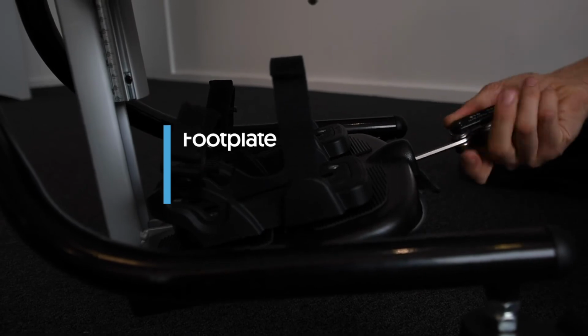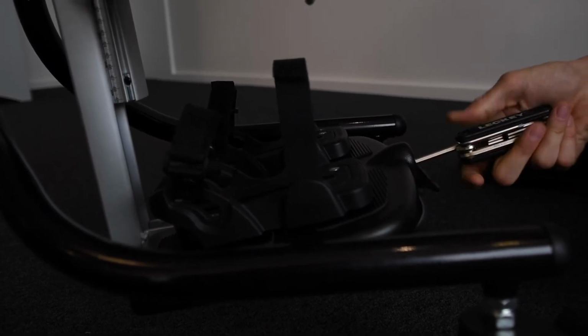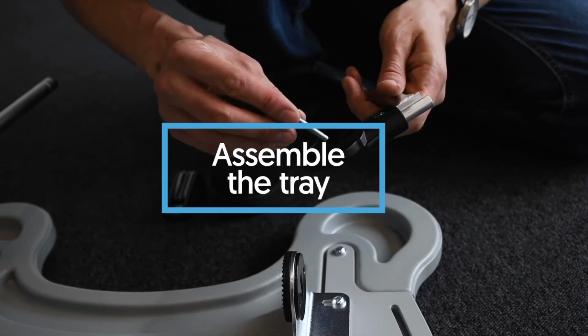Footplate. At the front of the footplate is an Allen bolt, which will allow for a degree of plantar flexion or dorsiflexion. To achieve the desired position, simply turn the Allen bolt on the front of the footplate either left or right. Assemble the tray.